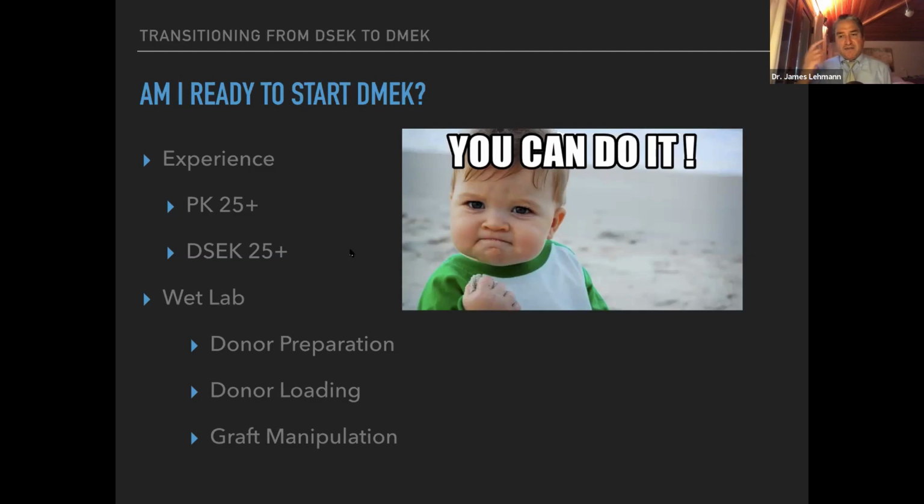Now, the skill set involved in DMEK is different than DSEK, and a lot of surgeons now learn it at the same time in the United States in their cornea fellowships. But what DSEK teaches you is about air management, bubble management, how to pick the right patients, how you can deal with postoperative complications and such. So I think it's important to have done DSEK prior to learning DMEK.